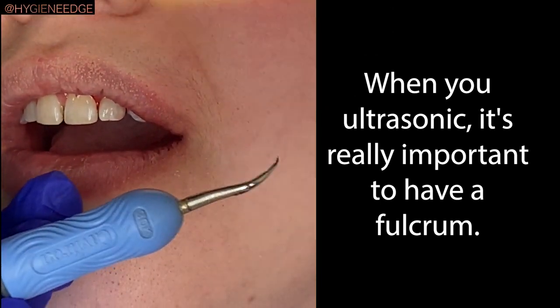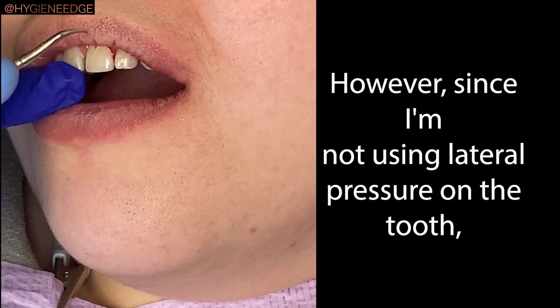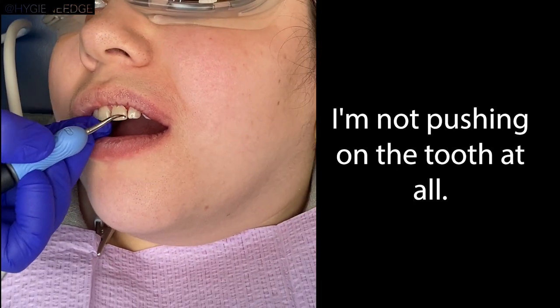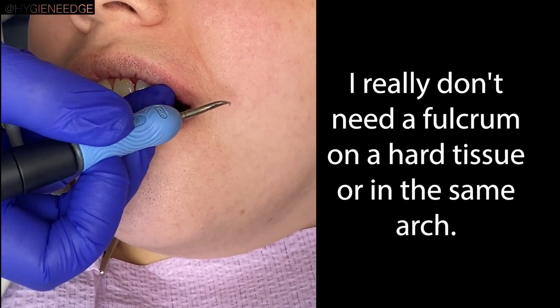When you ultrasonic, it's really important to have a fulcrum. You definitely want a fulcrum somewhere. However, since I'm not using lateral pressure on the tooth — I'm not pushing on the tooth at all — I really don't need a fulcrum on a hard tissue or in the same arch.